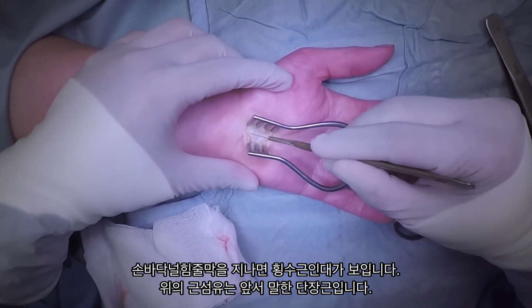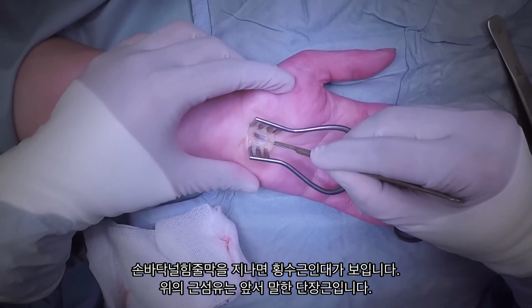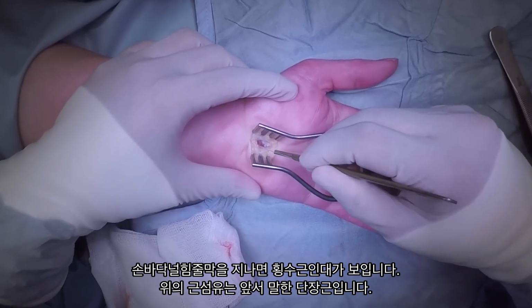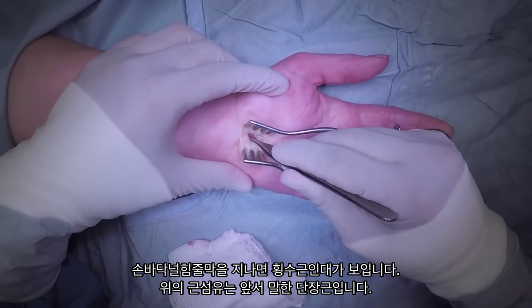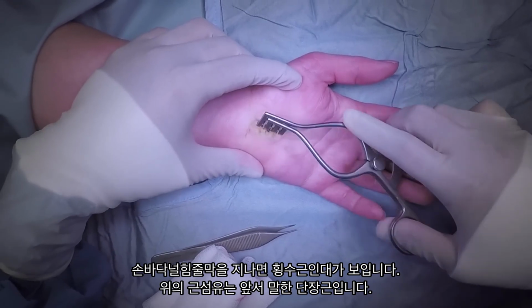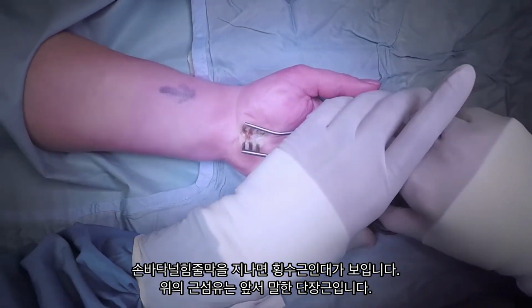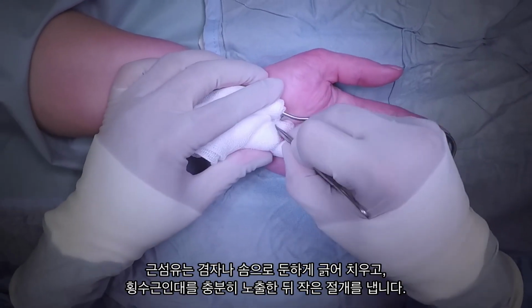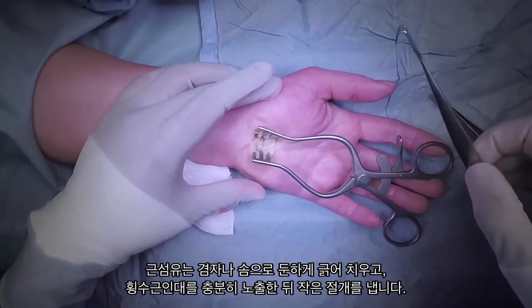You can use blunt dissection to go through this, but it's probably easier to incise it using your scalpel in line with your skin incision. Once through the palmar fascia, you've reached the transverse carpal ligament. Here we can see some muscle fibers overlying it, which are from our palmaris brevis muscle that we mentioned earlier. Let's resite the West retractor, putting the teeth underneath the layer that we've just divided to improve our field of view. The muscle fibers are in our way, so we're going to get rid of them by bluntly scraping them off the transverse carpal ligament using our forceps or a swab.